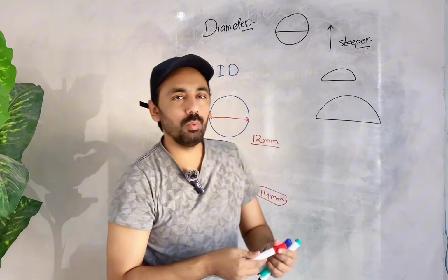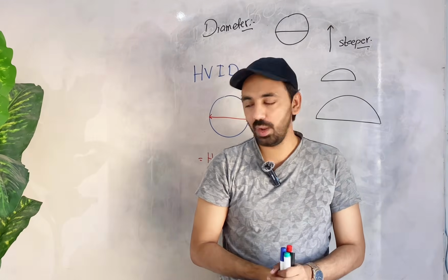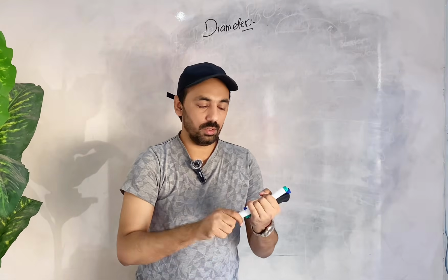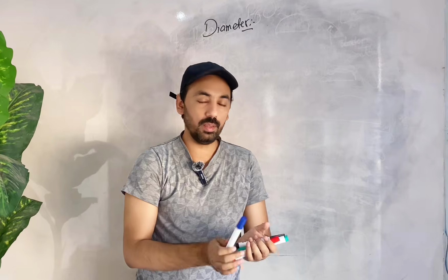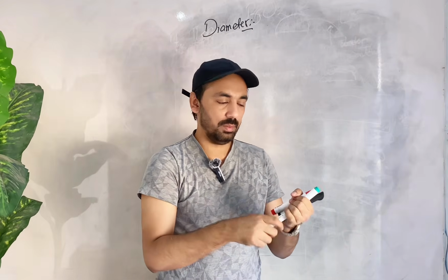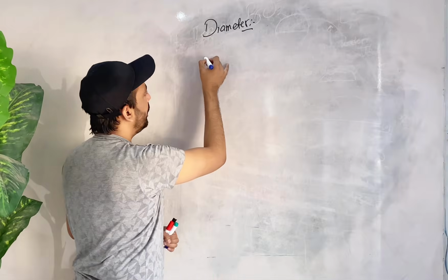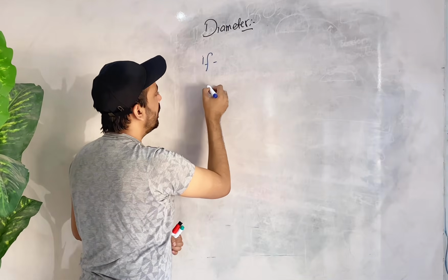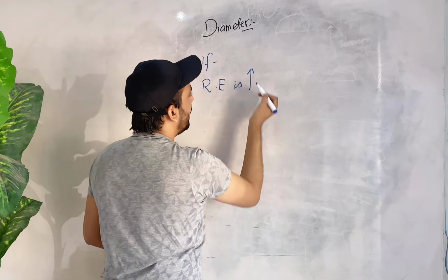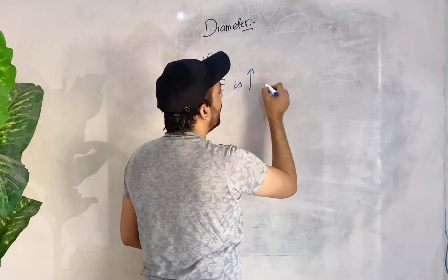So now we will discuss certain conditions, right? For example, if the refractive error of the patient is so high, meaning it's up to 10, 12 or more diopters, for example. So we are putting some conditions. If the refractive error is high, then what will we do?